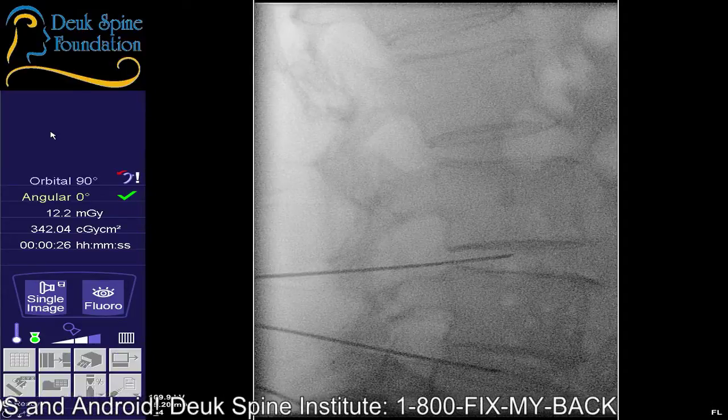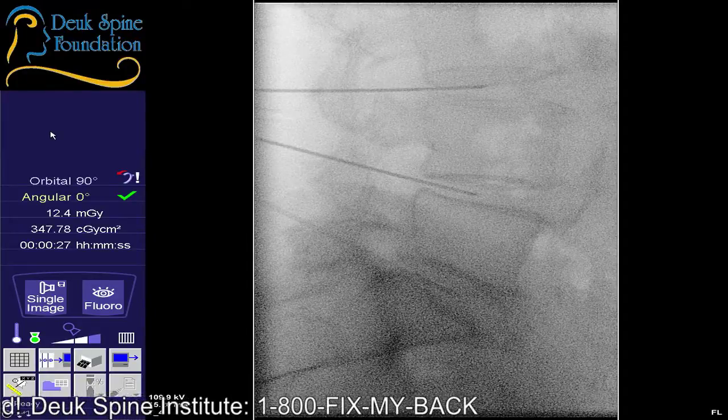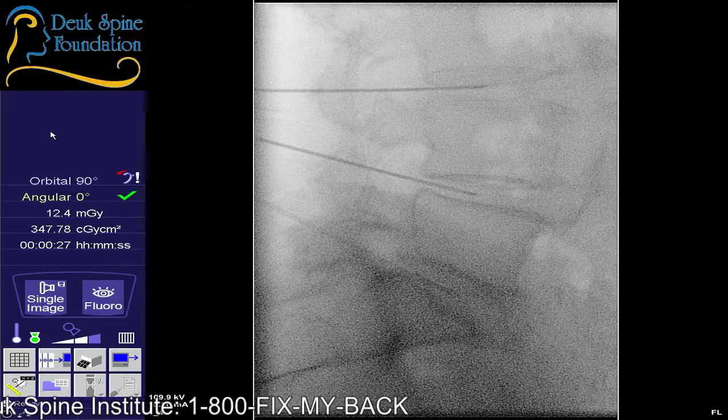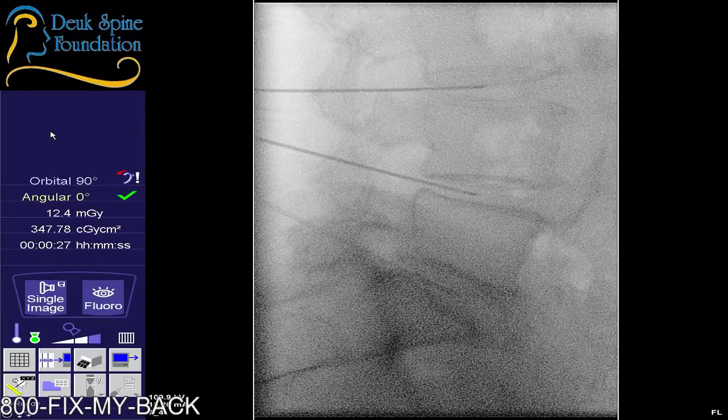Okay. Is she comfortable? Can you feel my hand? Can you feel his hand? Feel his hand touching your back. Okay. Are you with it? Are you comfortable? All right. Well, I'm going to do the discogram, so she may respond.